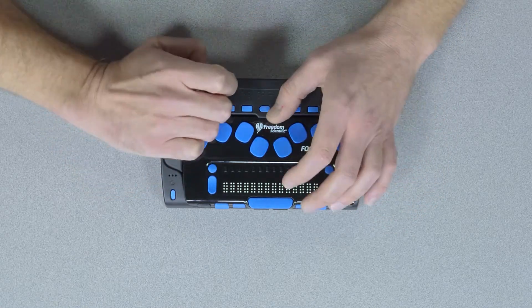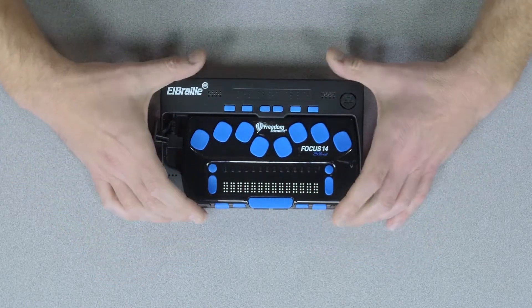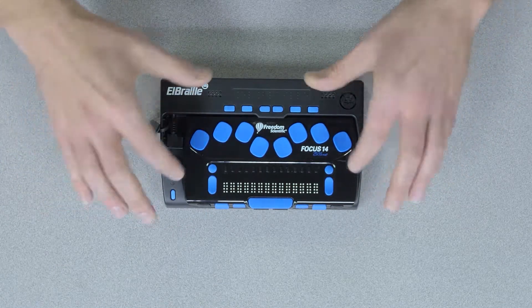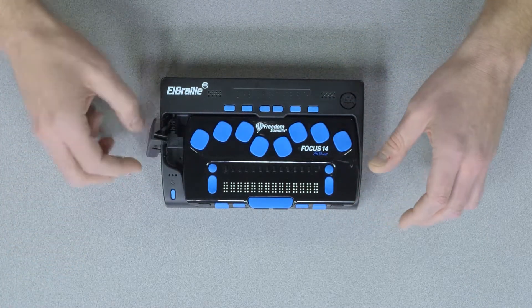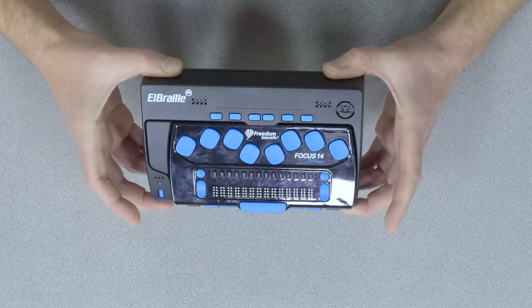You basically take off this little tab here, you insert the cord, and then you dock the Focus 14 in there. At that point these are now one device — you have inserted the Braille display into the LBraille and they are together, being powered by the JAWS software. So once you have that together you can cover that up and now you have your LBraille device.